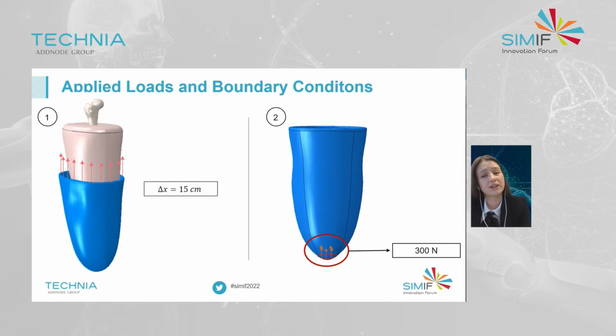The application of finite element analysis enables us to simulate the different activities performed by the patient, for example, jumping, walking, distinguishing different gait phases like heel strike, mid stance, or toe off. And in the second step of this analysis, following simulation of the donning procedure, the load case used was a surface traction load, which represents 300 newtons, and it represents double leg stance.